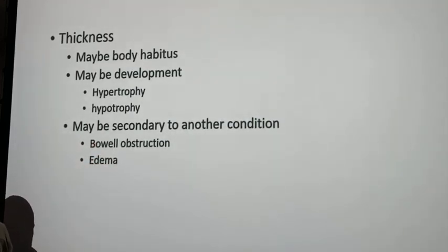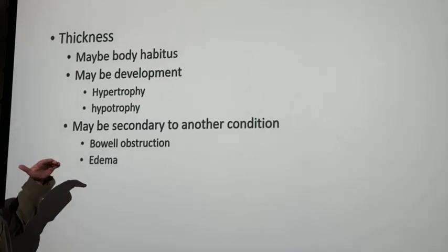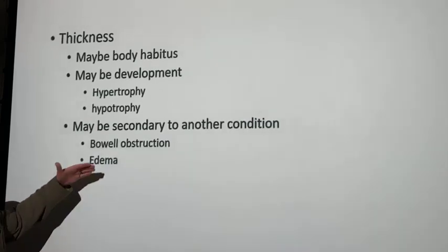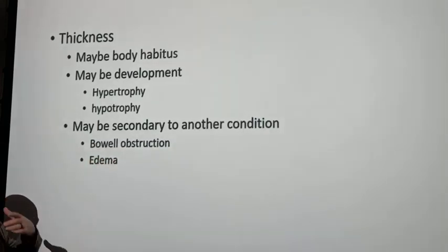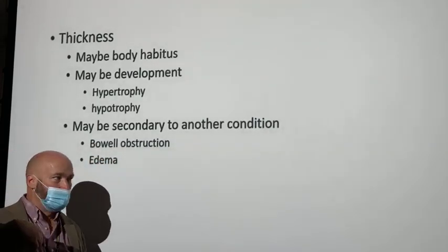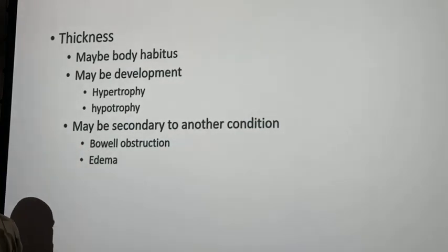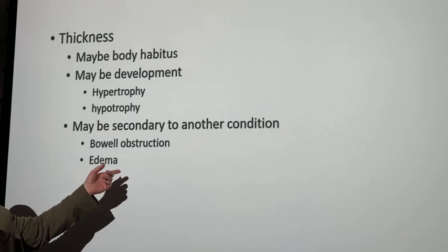It's what you call triage. You evaluate your patient, and if they've got this big distended abdomen and nothing else going on, then it's their anatomy, and there's probably a lot of fluid. As opposed to if they've got those indicators, the NG tube hooked up to suction, the canister full of bile, they're probably full of air.